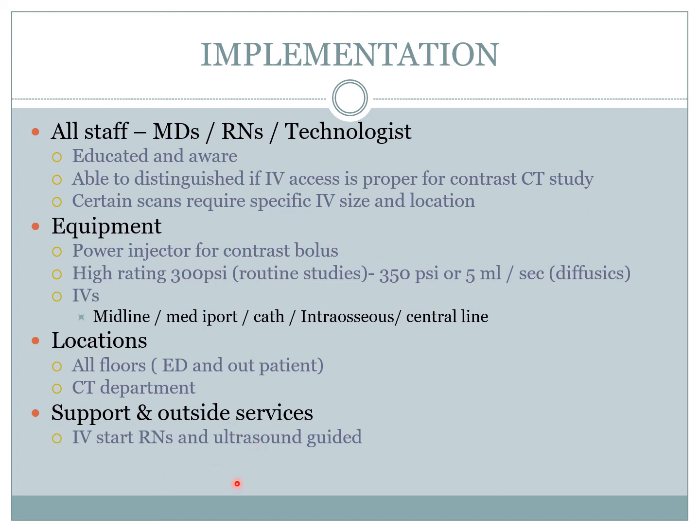And support and outside service, IV start nurses, that's their job. Their job is to get IV access on a patient that's difficult, because some people are drug users, some people just don't have veins, whatever it is, some type of medication they are. Or if one arm is not capable of having it because that's their dialysis arm or whatnot.